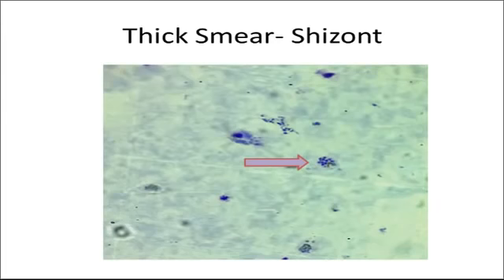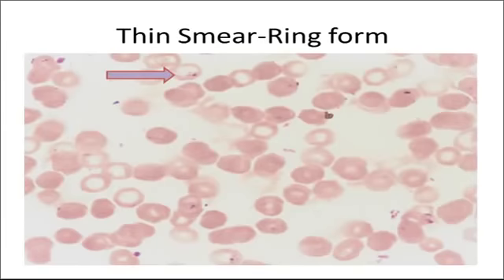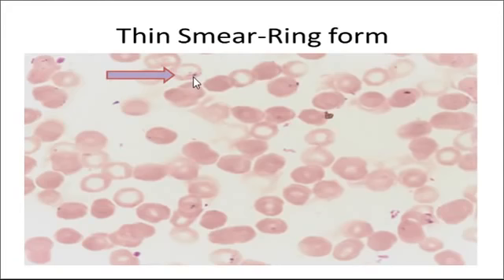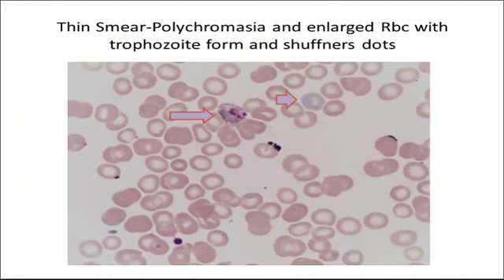Now we go to the thin smear. I apologize for the poor quality of this image — the ring form is not very well seen here, though it was seen clearly under the microscope. We can make out the chromatin dot, a trophozoite form, and Schüffner's dots.